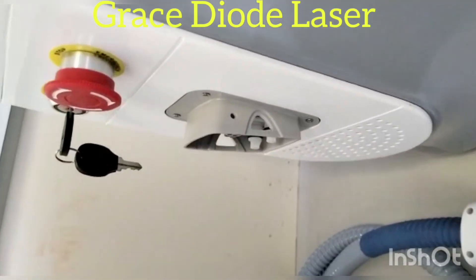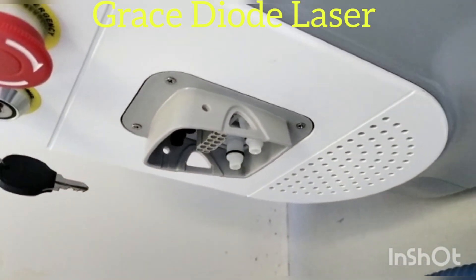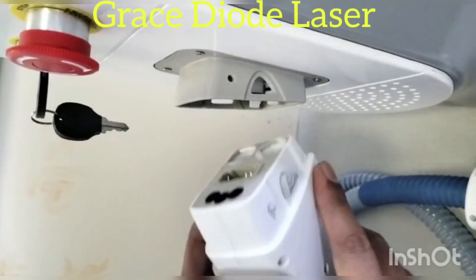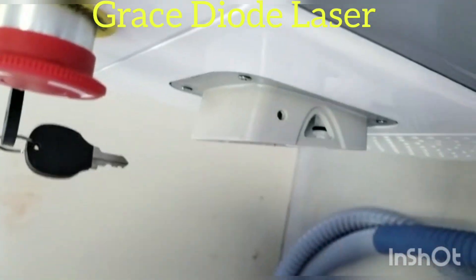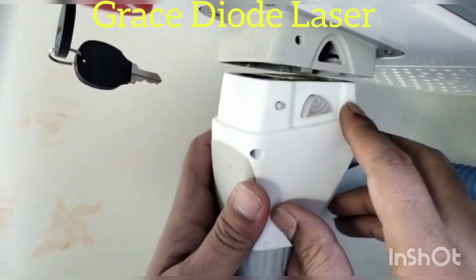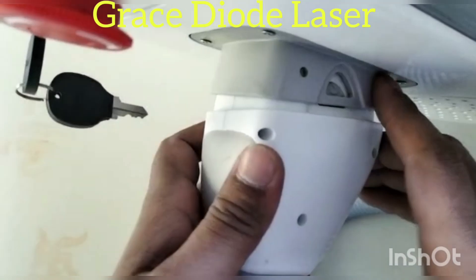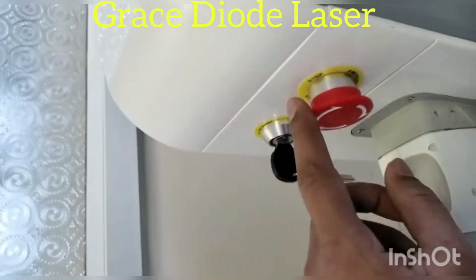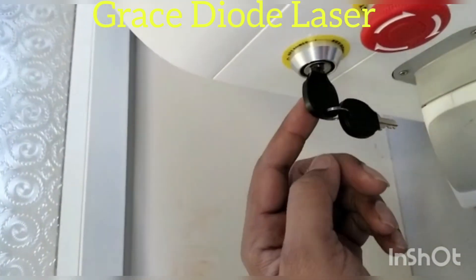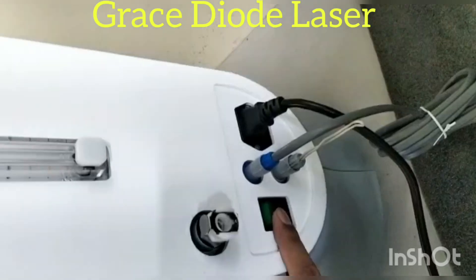This is a handpiece socket. Press the button and push. This is a handpiece holder. This is an emergency, this is a power key. Now press it on.